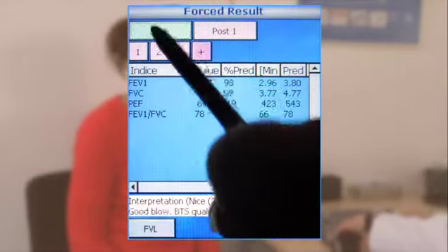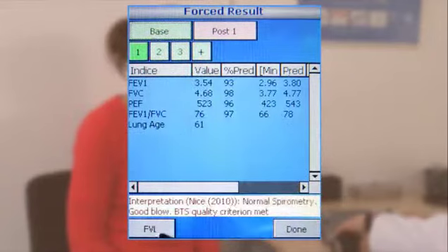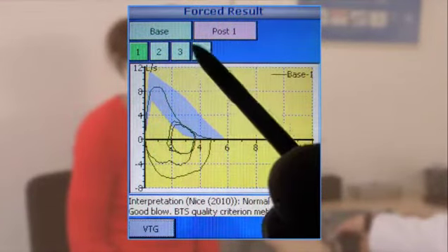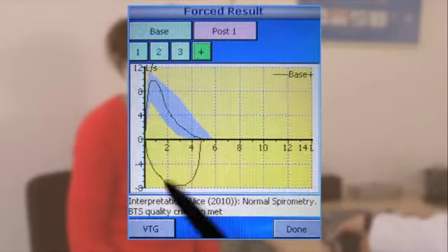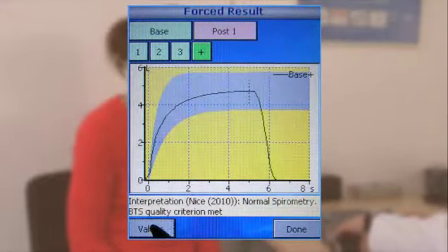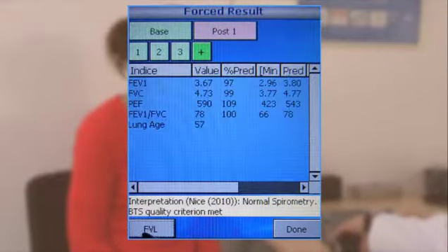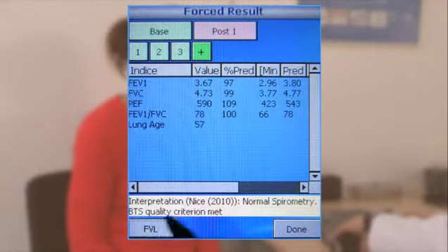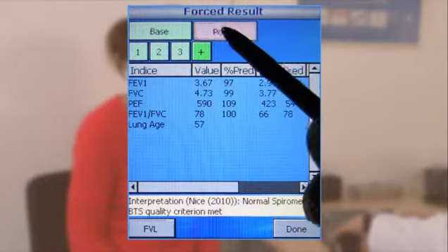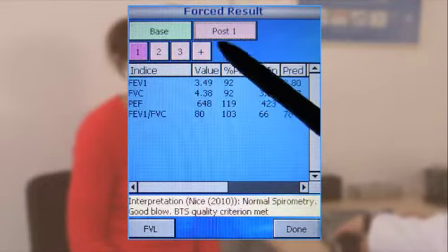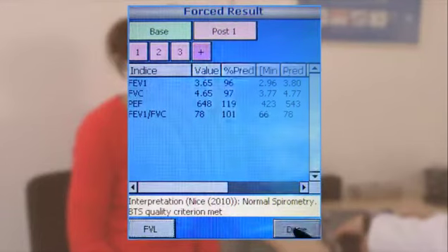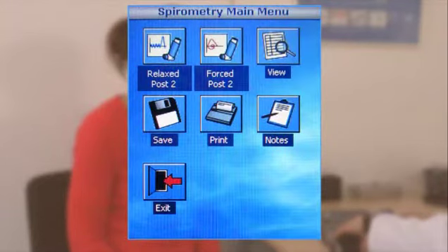A plus sign in a box indicates the best individual result. You may have chosen best blow criteria during customisation individually — for example, FEV1% of predicted. The best blow based on this criteria will be highlighted with an asterisk.